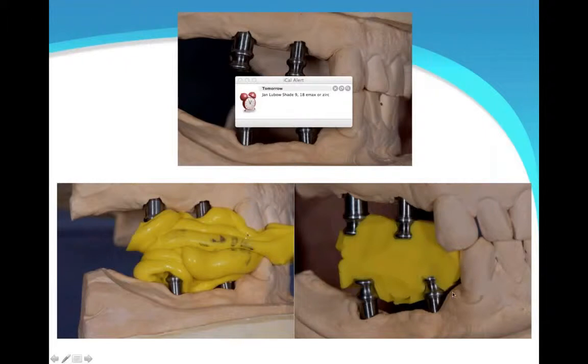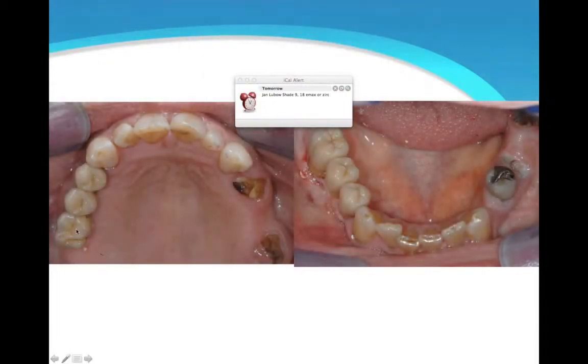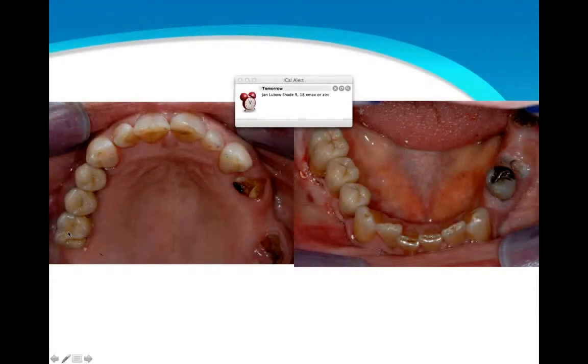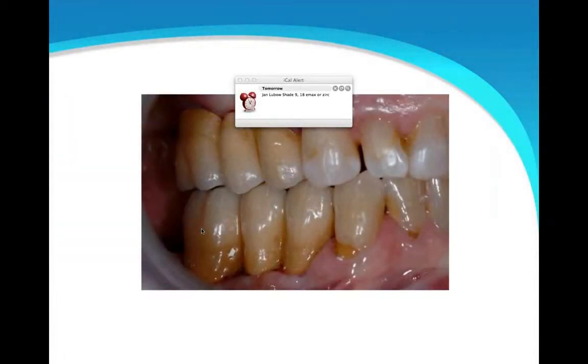Again, when you take a bite and you remove all tissue contact, you know you're accurate, and these two arches, with no occlusion on the other side, go together ideally. I set this bite just easy, set it, we made it. Here it is right after seating, and it's seated easily. It's actually as good or better than a preparation. There it is from the side immediately afterwards.